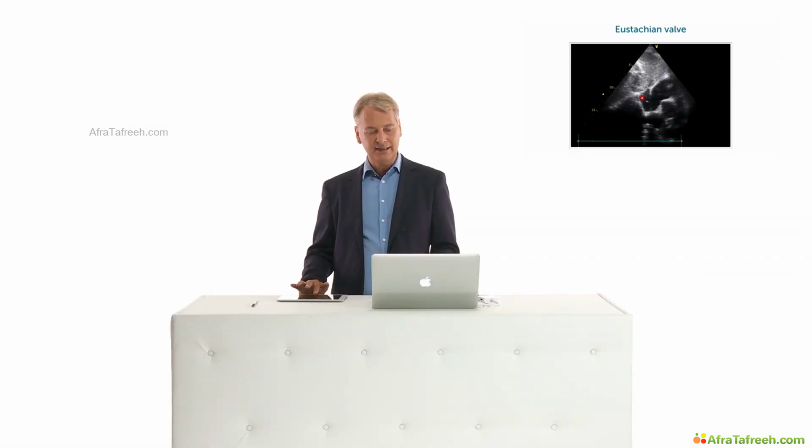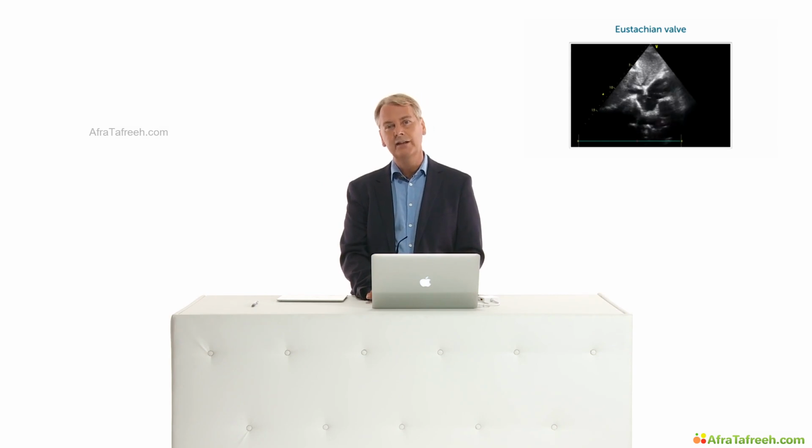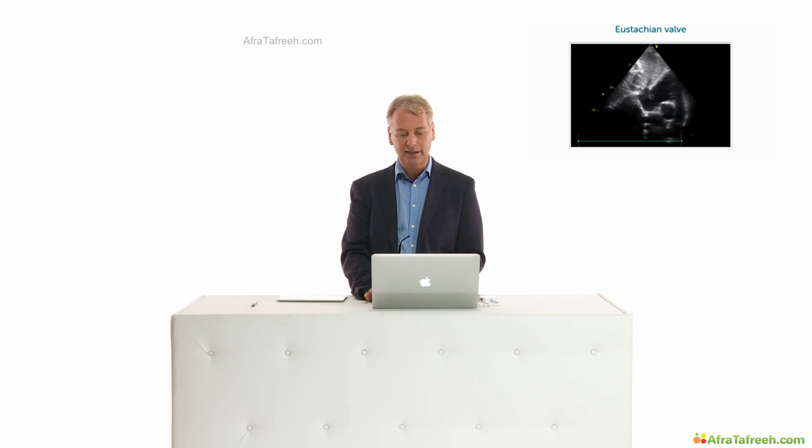The size of the Eustachian valve can vary greatly. Sometimes it's very small. In other situations, as in this case here, it's quite large. Sometimes it's quite difficult to differentiate the Eustachian valve from a so-called rete Chiari or Chiari network. I'll talk about that pathology later.